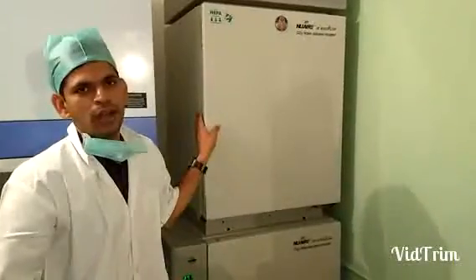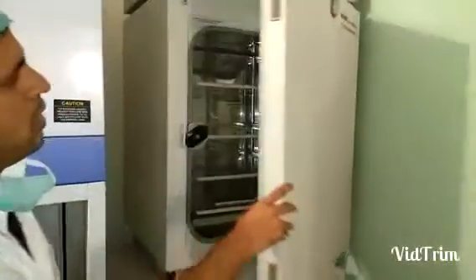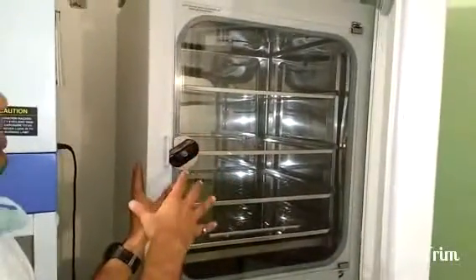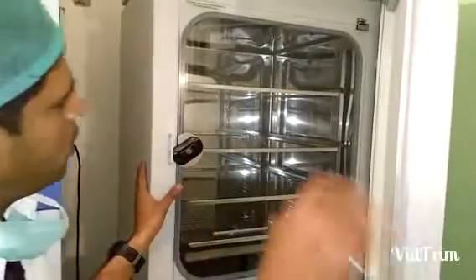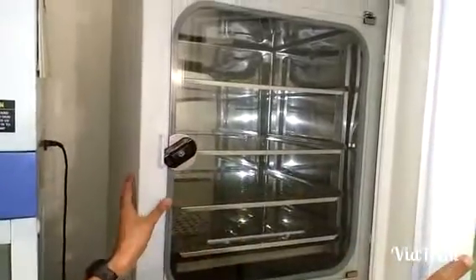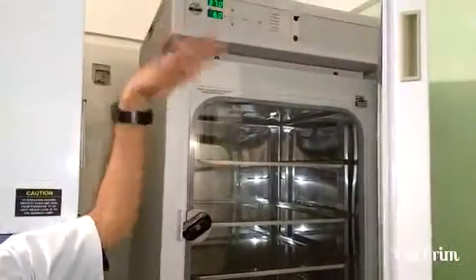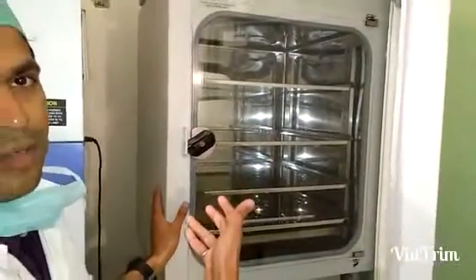Now I will quickly show you how the incubator looks like from inside. The incubator has two doors — the outer door and the inner door. The inner door, as you can see, is transparent, made of glass, so that you can peek inside without opening the door, because opening the door affects the temperature and CO2, and it takes a lot of time for recovery.